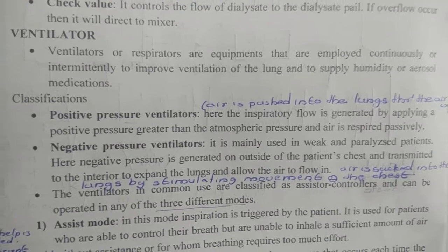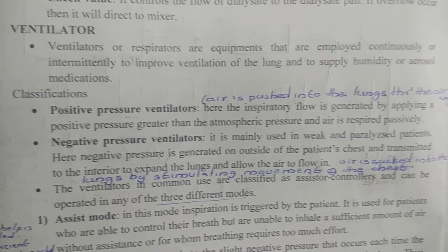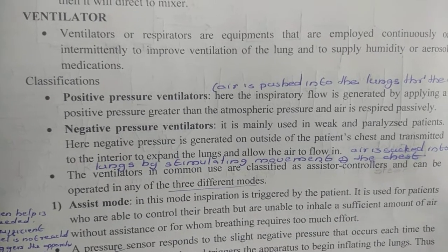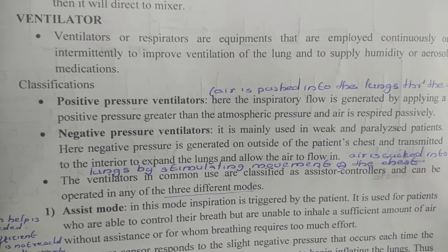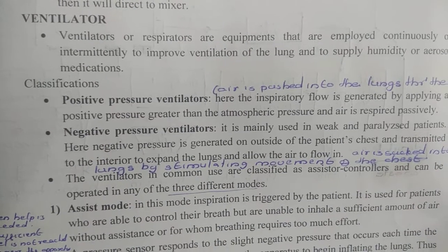Hello friends, today we are going to deal with ventilators. Ventilators are devices which are used to improve or help the patient to respirate.